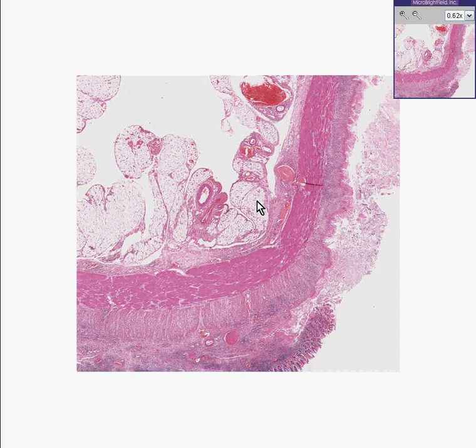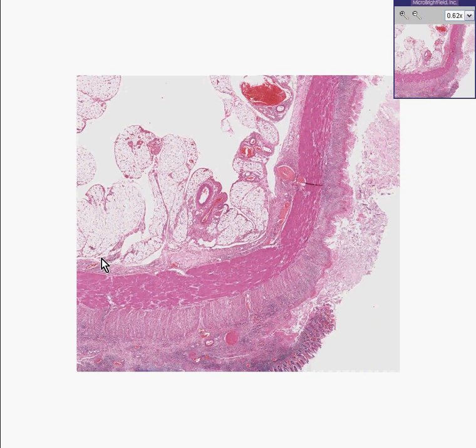Here is another colon, as you could see. Here's a large blood vessel within pericolonic fatty tissue. Here's the serosa or adventitia, depending on whether this was part of the colon that was retroperitoneal or not. Here is a large thick muscular layer of smooth muscle. Here is a submucosa.